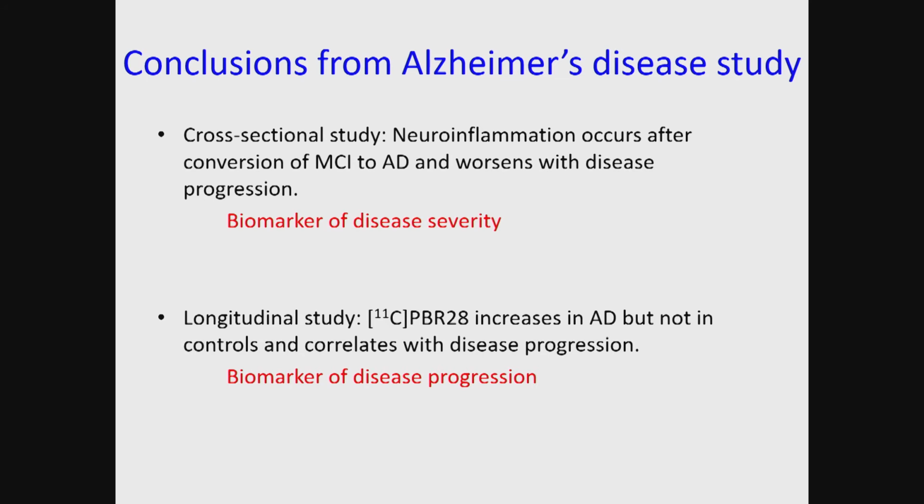These are small pilot studies that need to be replicated in other centers, and I think largely they are being replicated. So this shows how a marker of inflammation can be used in ways that sound pretty important, disease severity and disease progression, when you consider therapies that might be tried. And anti-inflammatory therapies are worth, I think, reconsideration in patients with Alzheimer's disease.